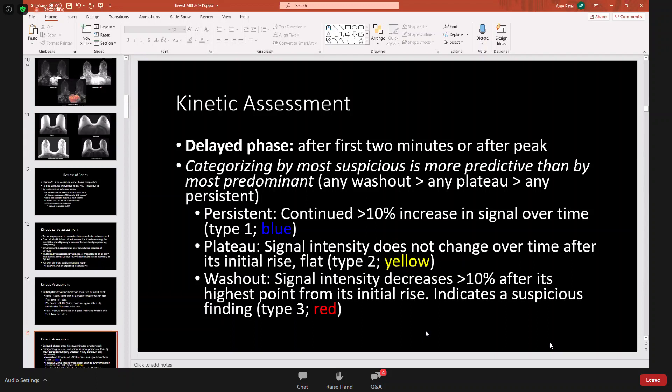The plateau or Type 2 kinetic curve is characterized by an initial rise in signal intensity that then remains flat — the signal intensity does not change over time after that initial rise.